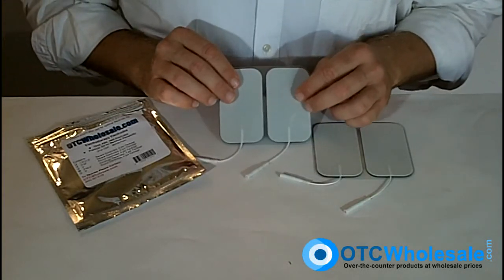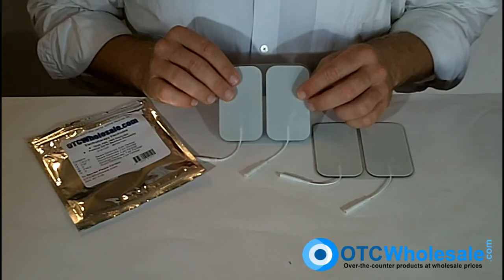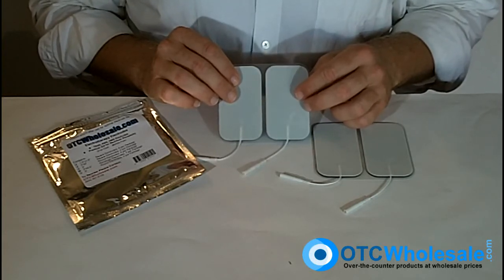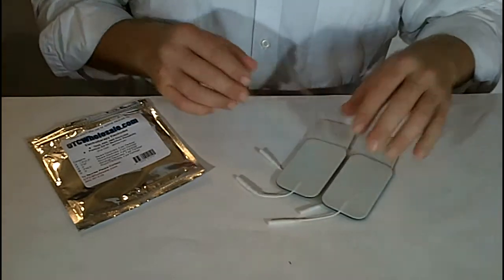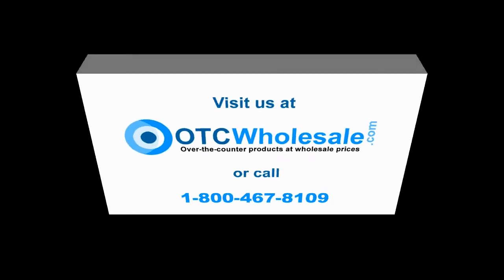These electrodes are perfectly suitable for any type of electrode stimulation, whether it's a TENS unit, muscle stimulator, interferential unit, or galvanic. They are excellent value and excellent quality. All of these products are available on otchwholesale.com, or you can call us at 1-800-467-8109.